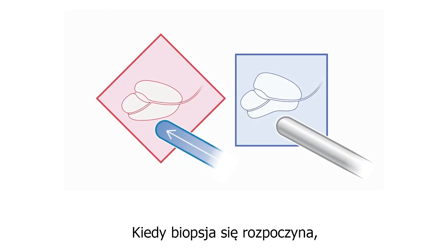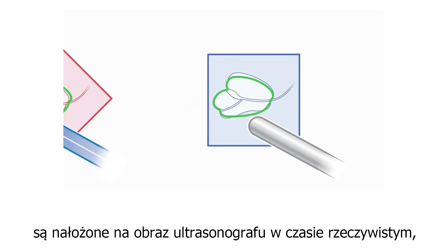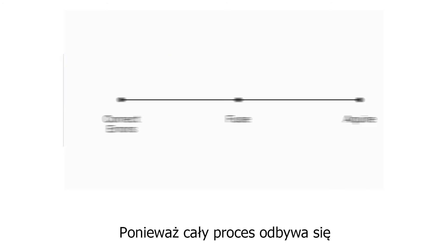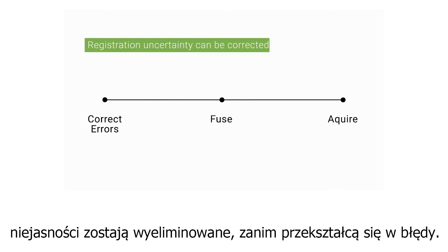When the biopsy begins, the prostate MRI contours are overlaid on the live ultrasound image, providing you a guide to match. And since all of this happens before capturing an ultrasound image, it means that registration uncertainty can be corrected before it becomes an error.